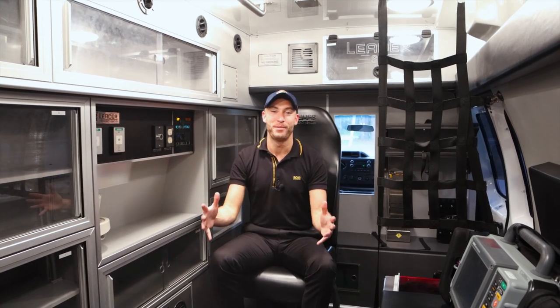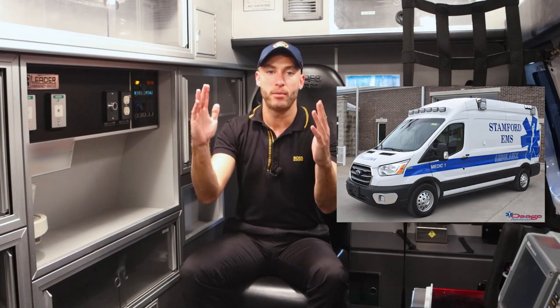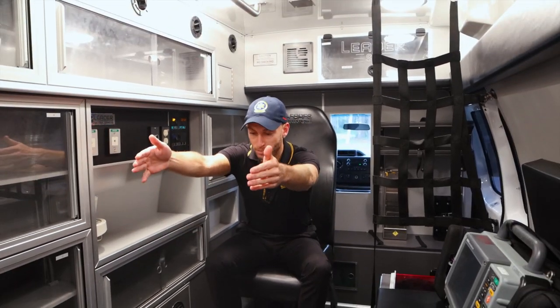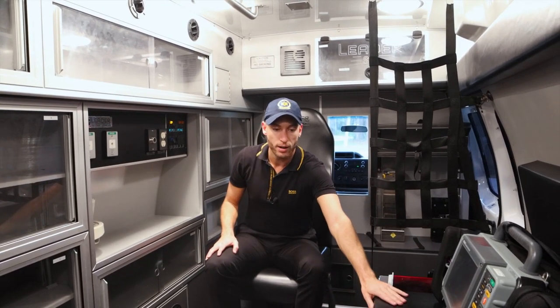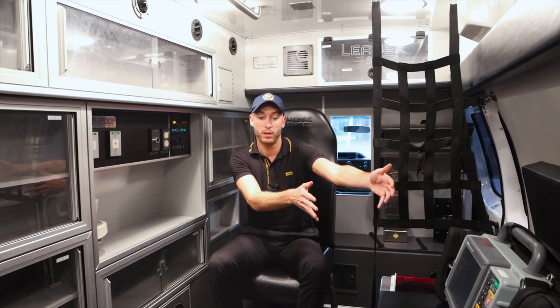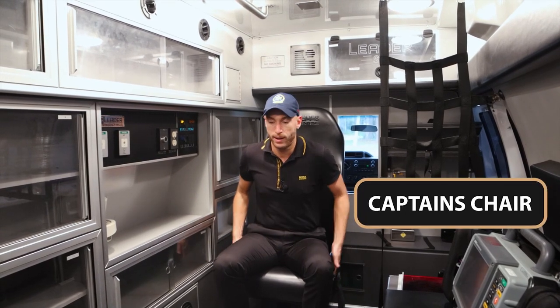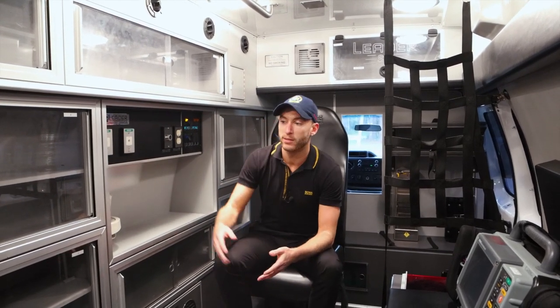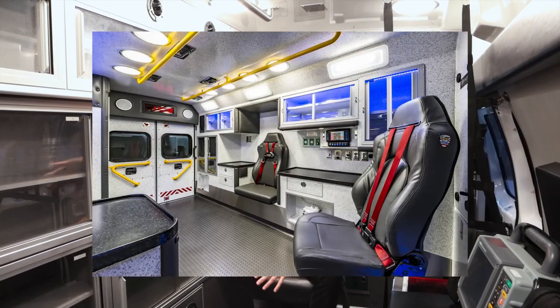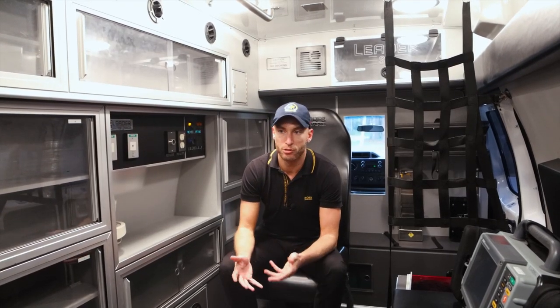So here we are in the back of the ambulance. This is where we do our work, our patient care. Now what we have here is a type two ambulance — this is not a box ambulance, it's a van ambulance. There's just about enough room for the stretcher, and the bench seat right here is where you'd actually be sitting next to the patient doing care. There's also another seat here — this is called the captain's chair. In a box ambulance, there is another seat over here where the cabinets are.